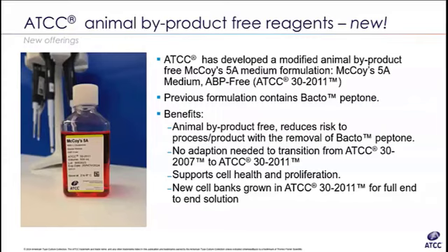Here's a great question. What could be a reason for my cells unexpectedly detaching from the plate? Yeah, so there's a few reasons this can happen. Most often it's due to suboptimal media pH and incorrect buffering. This can be from an imbalance of the percent of CO2 in the incubator and the amount of sodium bicarb in the basal media.